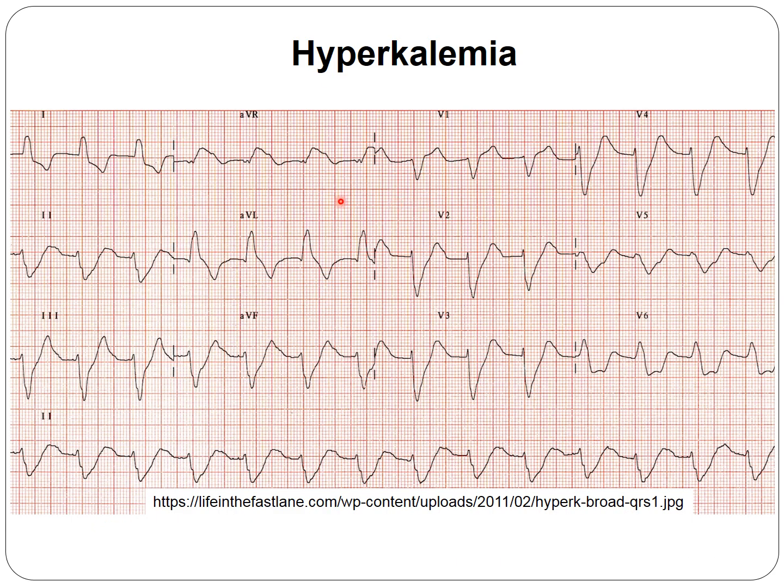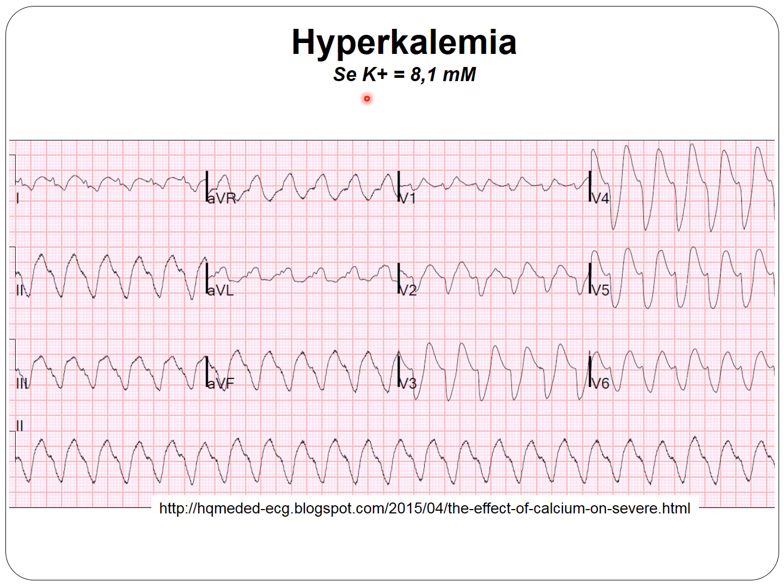In the next tracing, we see a regular rhythm and very wide, bizarre QRS complexes. The P wave disappeared. It looks like a ventricular rhythm, however this is not ventricular, it's a sinus rhythm, but due to the increased potassium concentration, the QRS is widened. With further increase in the potassium concentration, we have a sine wave representing depolarization, repolarization, depolarization, repolarization. And tachycardia occurred in this ECG tracing.